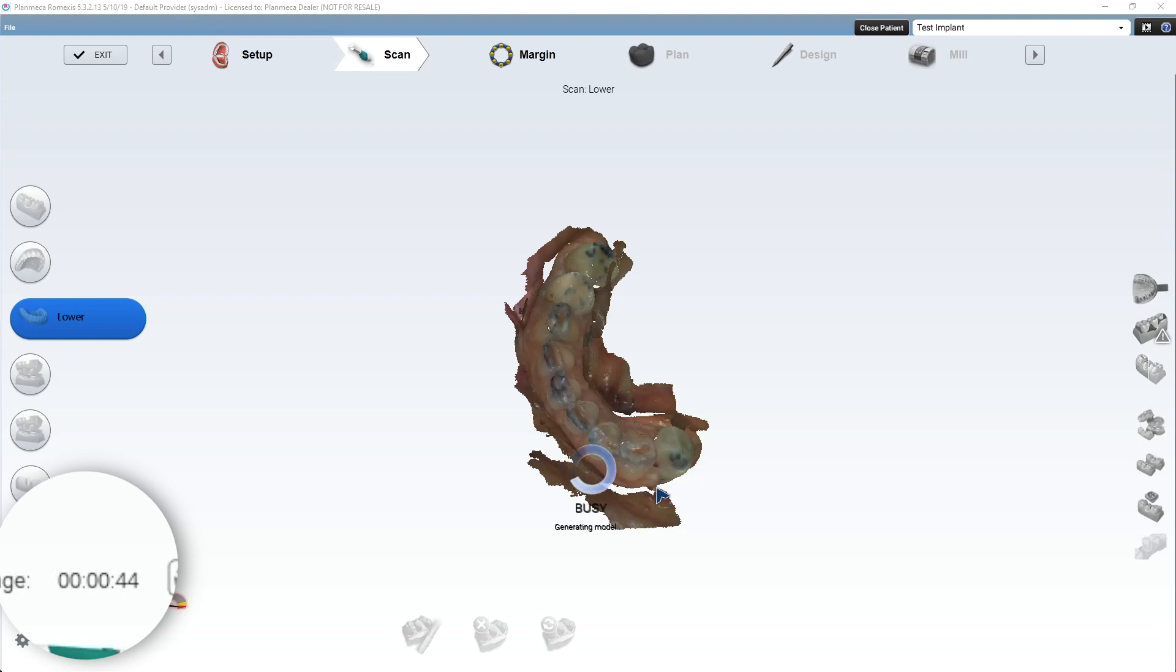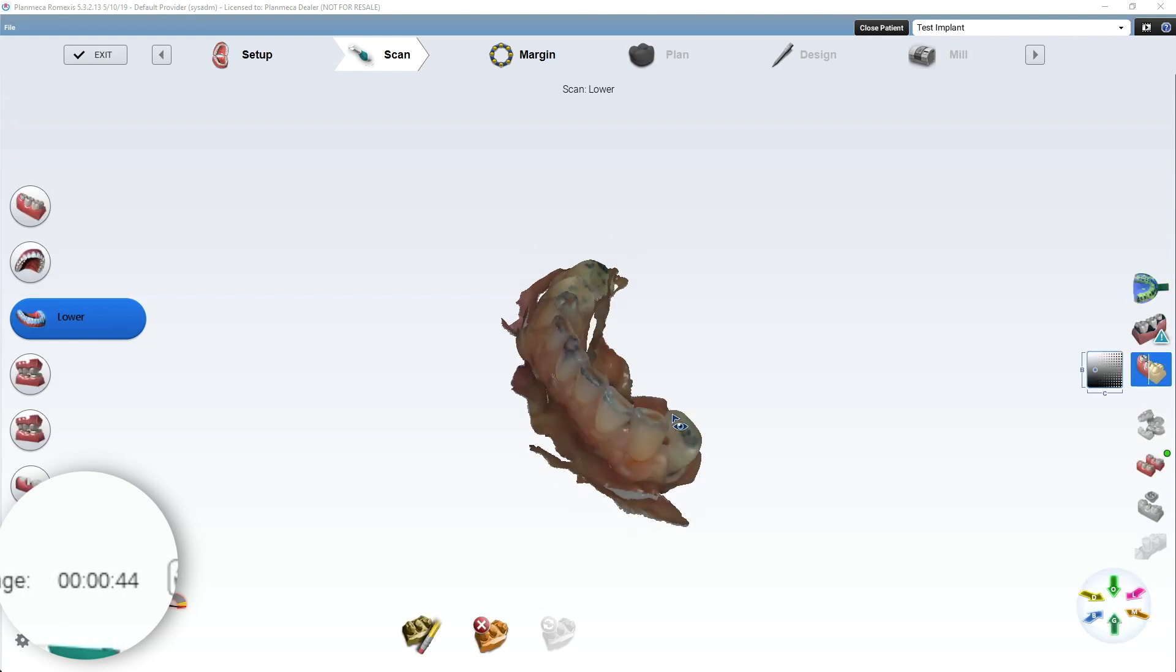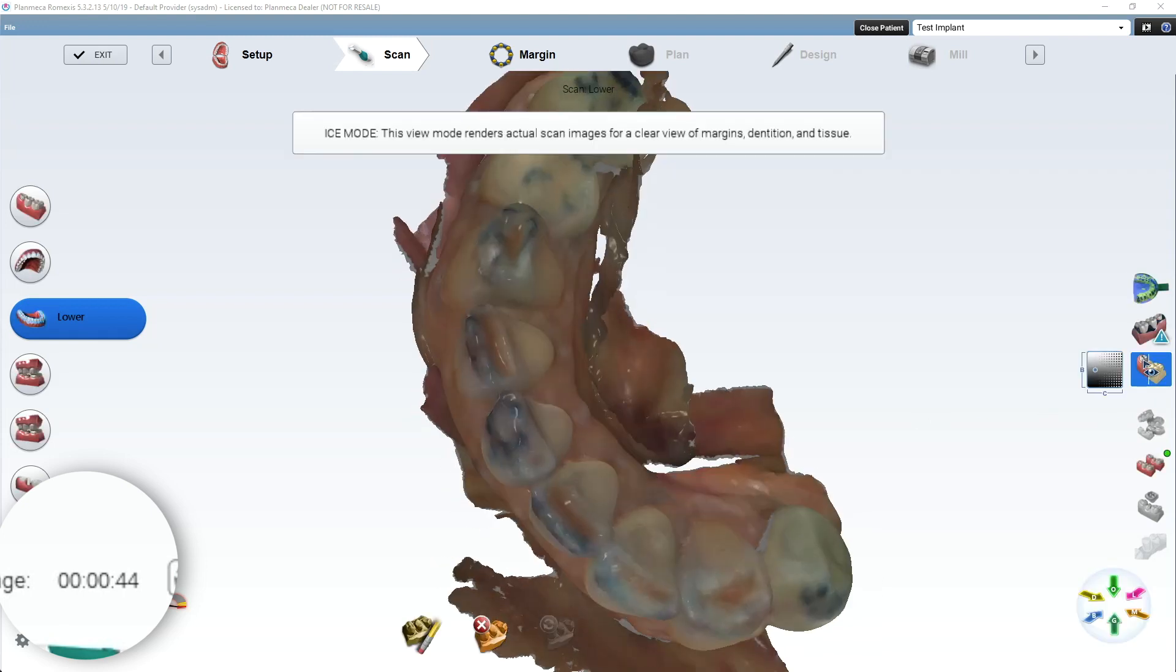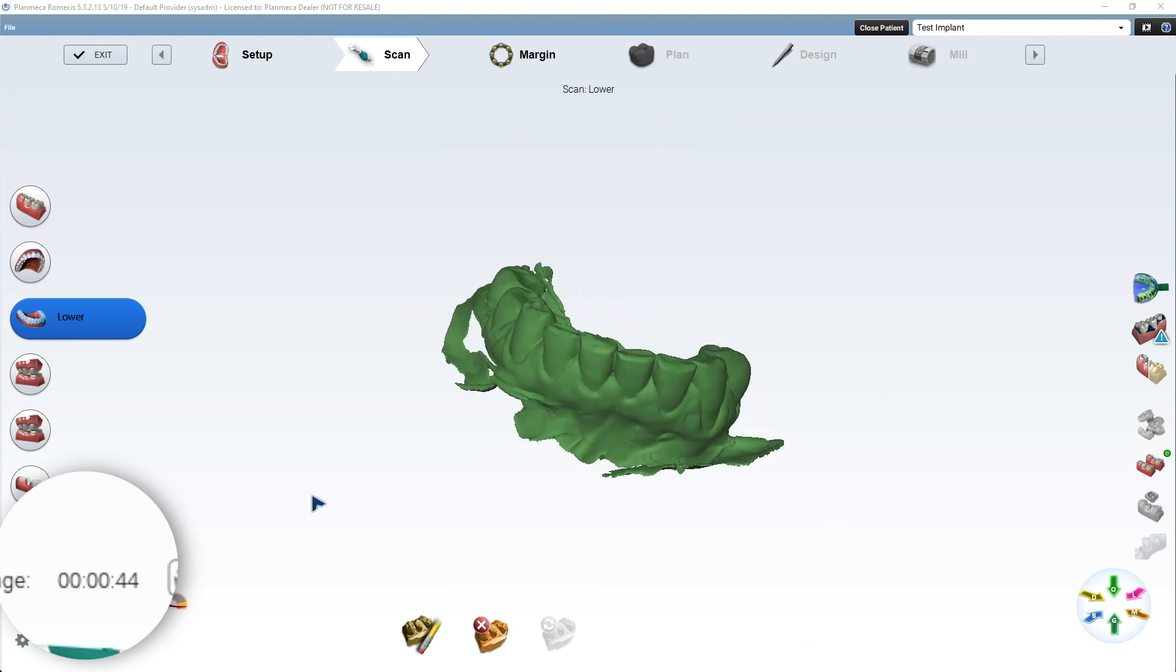And we're going to capture the buccal bite. Once again, I do kind of apologize for the real time. But a lot of people had just wanted to see real time stuff. So I'm slowing these videos down for you guys. So there's the lower. Now I'm going to go to the bite.